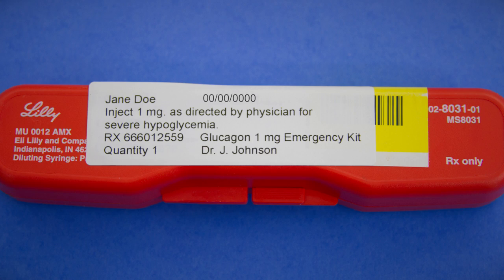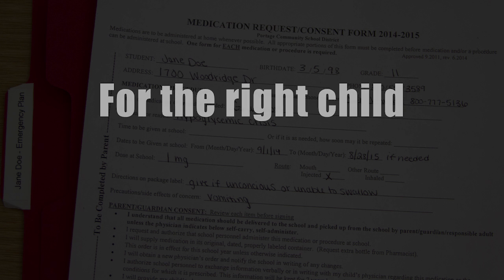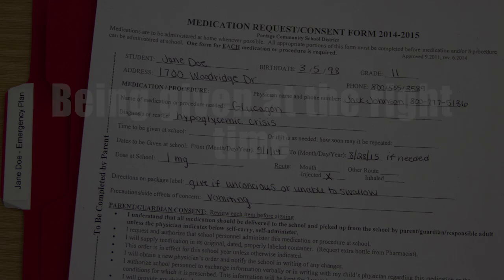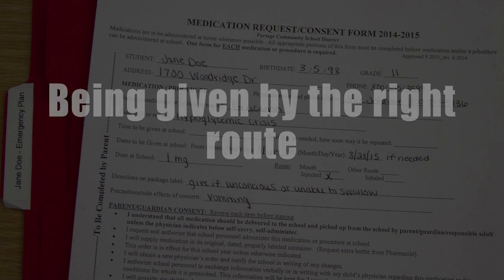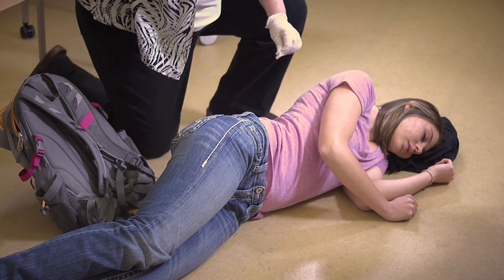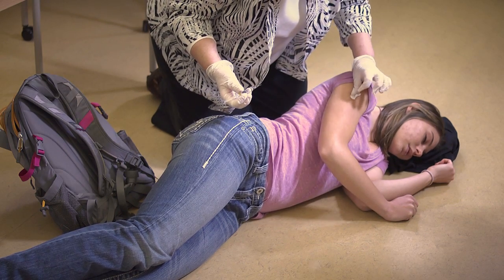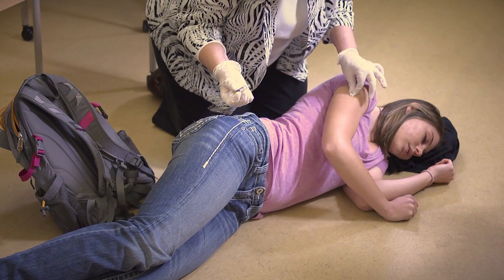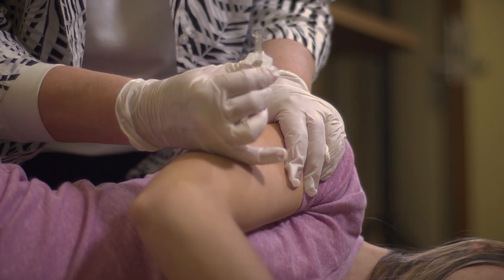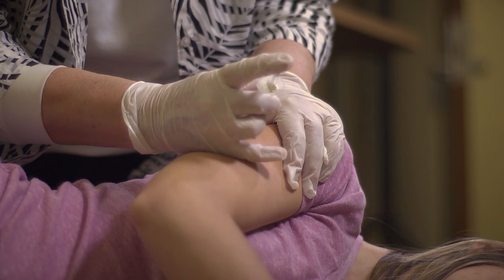Recheck the 5 rights again, checking the glucagon kit and order to be sure it is for the right child, the right medication, the right dose, being given at the right time, and being given by the right route. Identify the location, buttock, thigh, or arm for the injection. Cleanse the injection site with an alcohol wipe. Insert the needle into the skin at a 90-degree angle. Slowly inject the solution.